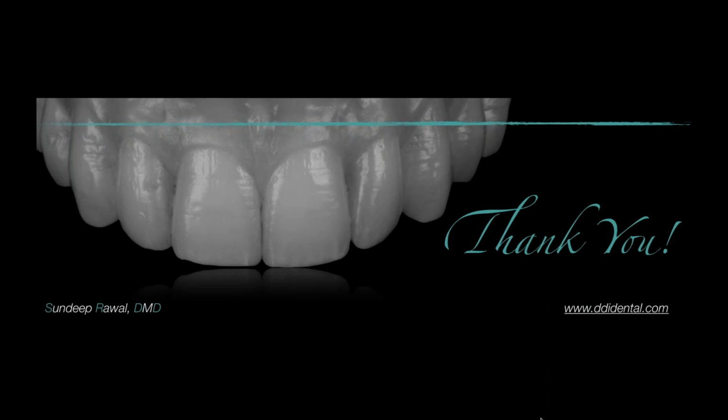So we've had new innovations in the last few years. Well, navigation's been out a little bit longer, but we've had a new innovation that is not static in nature, it's dynamic, meaning you can change your plan intraoperatively and still place an implant through a guided protocol. With dynamic guided surgery, there are two main ways of doing it.